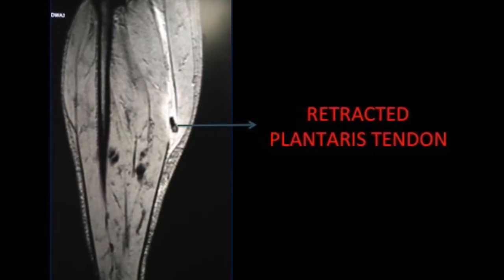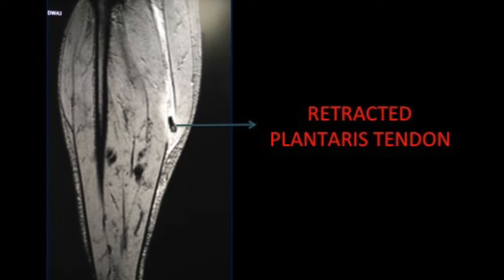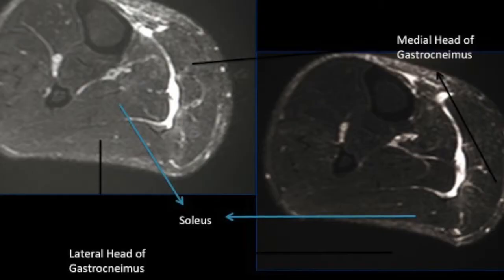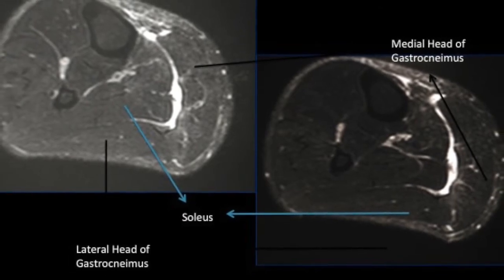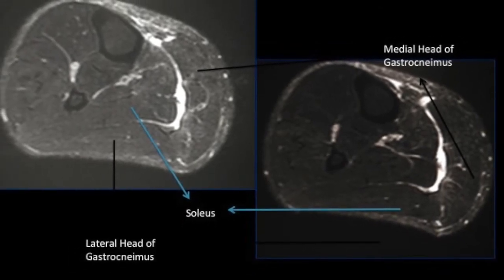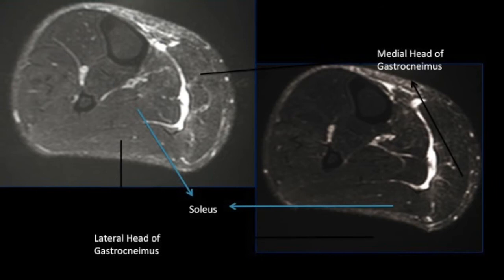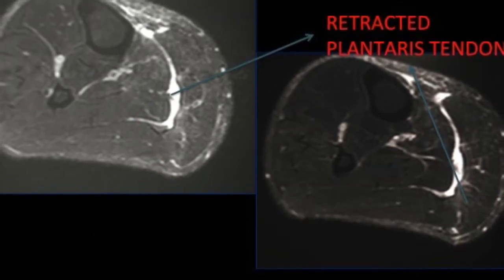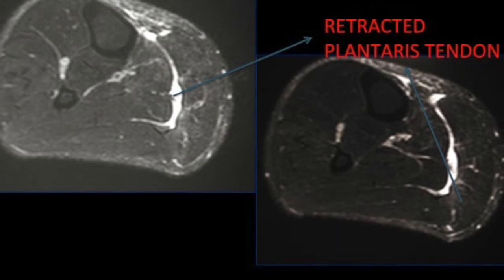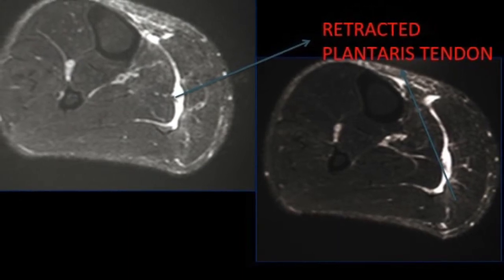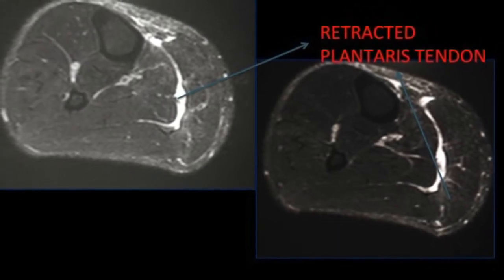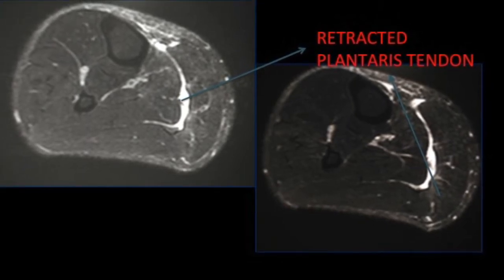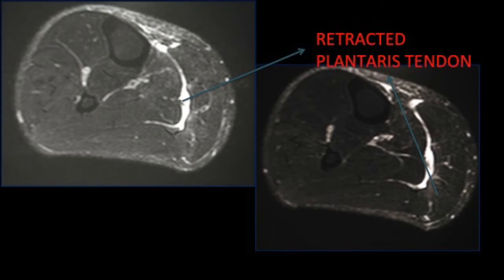Here are some examples in the labeled diagrams. The medial head of gastrocnemius is shown, along with the retracted plantarus tendon and the chink of fluid, all nicely seen. The retracted plantarus tendon is again demonstrated. There are also axial views showing the fluid in its typical location between the gastrocnemius and the soleus, with the retracted plantarus again visible.